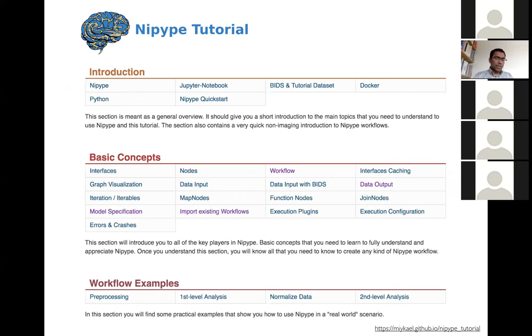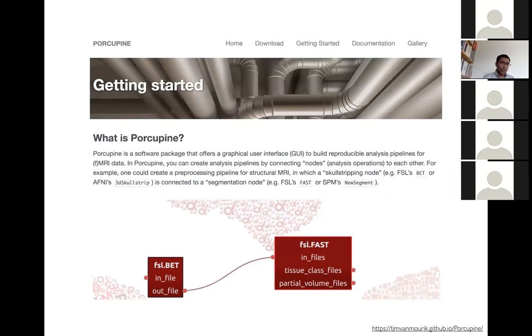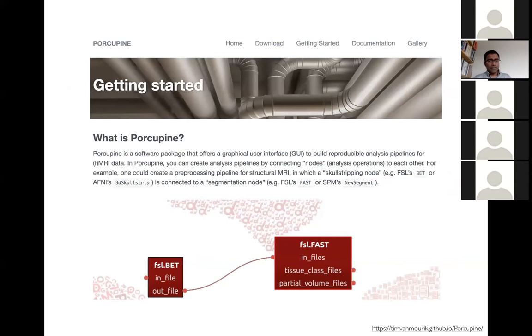For those who may not want to write Python, there is a graphical interface called Porcupine, created by community contributor Tim Van Moorick out of the Netherlands, which allows graphical creation of NiPype workflows. Instead of writing Python code, you draw blocks, connect them up to your data, and run them. Porcupine has extensive documentation to get you started and maps onto NiPype semantics.